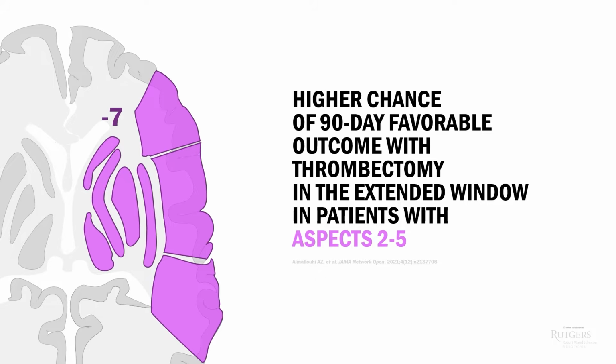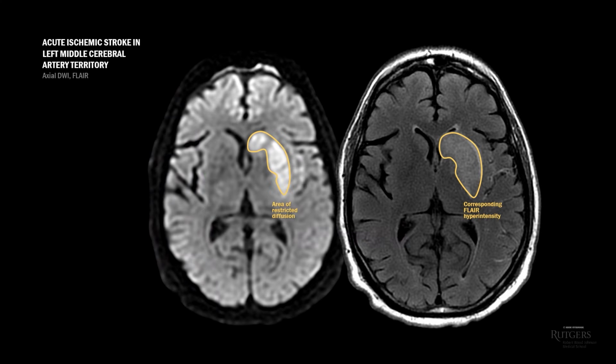Clearly we need a more reliable imaging modality to select patients for interventions. MRI is obviously the gold standard. Diffusion-weighted imaging, or DWI, abnormalities reflect actual histological changes that occur as a consequence of cerebral ischemia. But MRI is slow and cumbersome. Try getting a disoriented patient with a large vessel occlusion to stay still for 30 minutes inside the MRI machine. I'm being facetious. Most major stroke centers do have protocols to get MRI quicker, but CT perfusion is still more prevalent and only takes a few minutes.